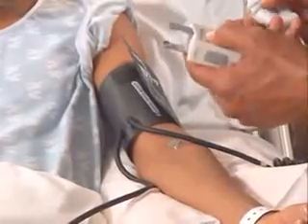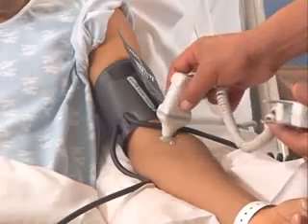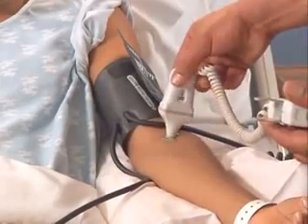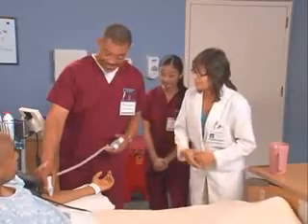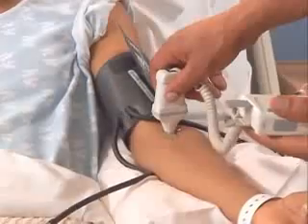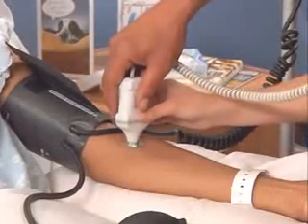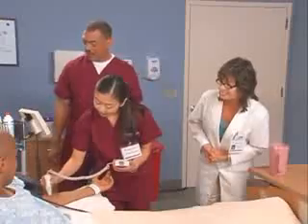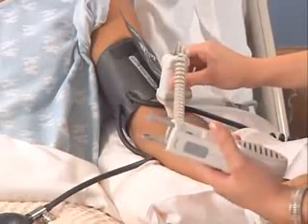All right. And place the Doppler tip in the gel. Move the Doppler tip around until you hear the pulse. Oh, sorry. You can adjust that volume. I get extra points for that. Rose, why don't you try it? Okay, sure. Move the Doppler around until you hear the pulse. Okay, there it is.